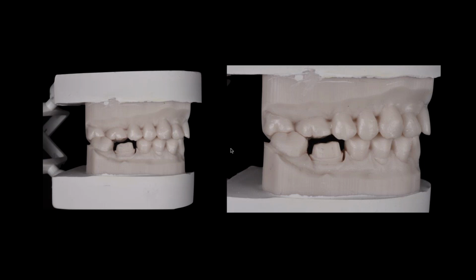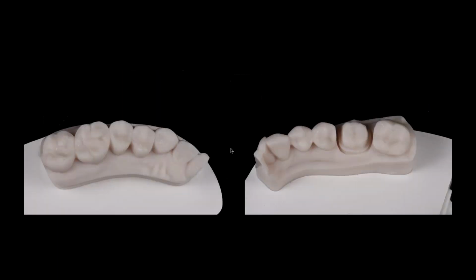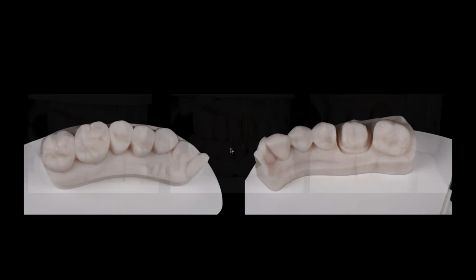In the beginning, we tried hard to incorporate the technology into the old school, and that was partly for us and partly for our doctors. I didn't want to just send what they used to receive, stop it, and just send something completely new. So we took our digital casts and we actually mounted them on old school bases with stone and plaster just to make them look a little more normal for the transition. And then as time went on, we started kind of getting away from that.